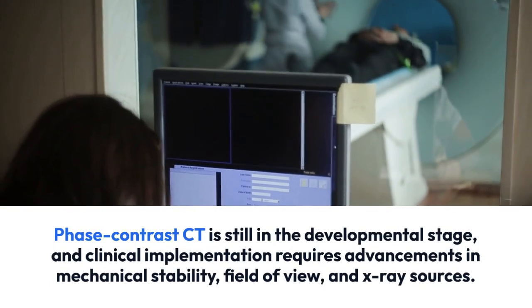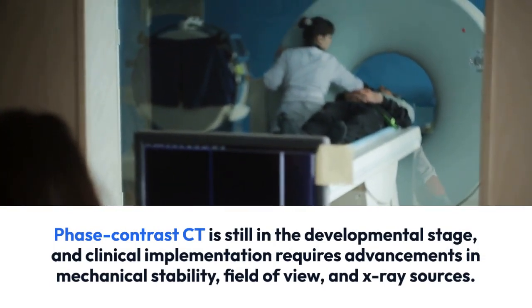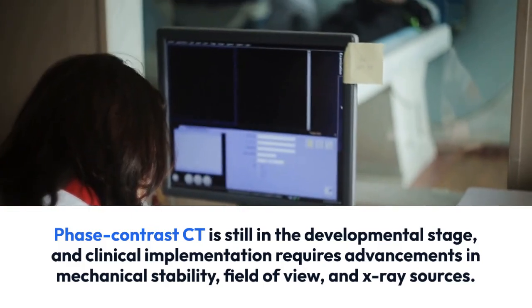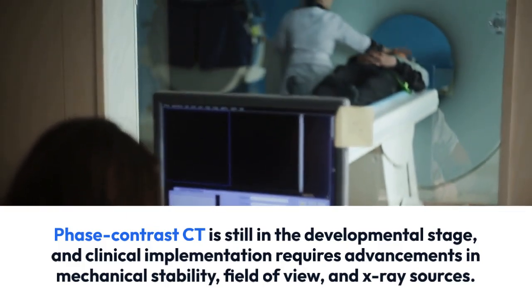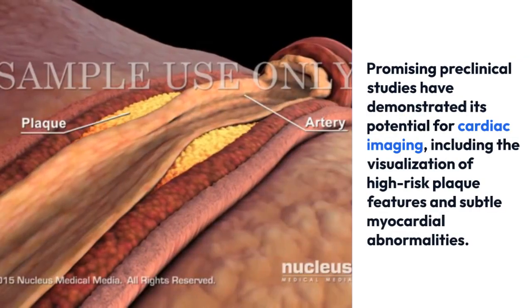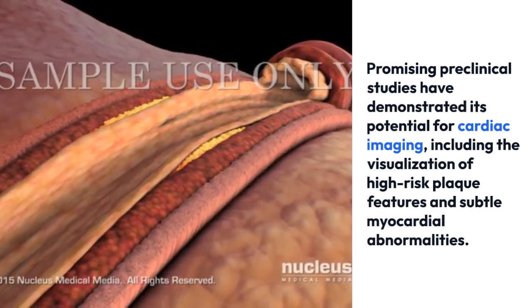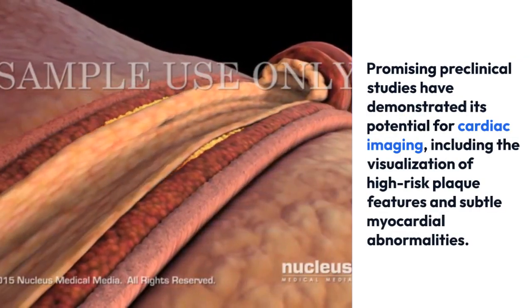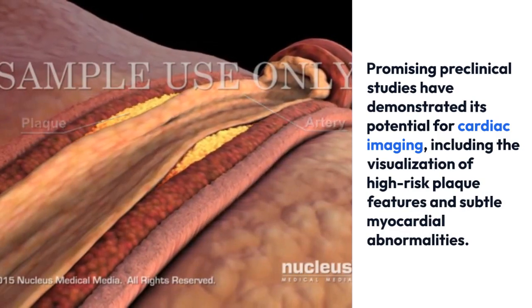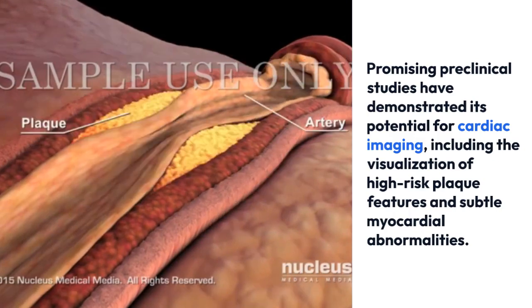Phase Contrast CT is still in the development stage, and clinical implementation requires advancement in mechanical stability, field of view, and X-ray sources. Promising pre-clinical studies have demonstrated its potential for cardiac imaging, including visualization of high-risk plaque features and subtle myocardial abnormalities.